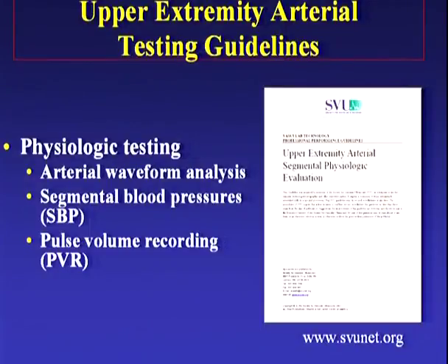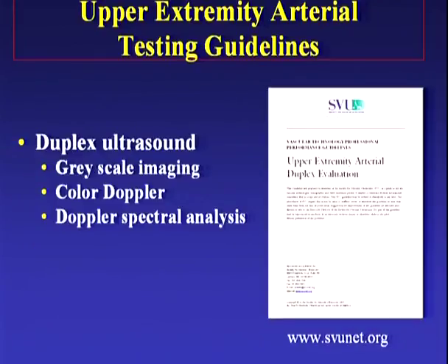As I mentioned, we're going to look at two guidelines throughout this DVD. The first one is a physiologic testing guideline, which is going to look at arterial waveform analysis, segmental blood pressures, and pulse volume recordings. The second is geared towards duplex ultrasound itself, and you're pretty comfortable with that, I'm sure: looking at grayscale imaging, color Doppler, and the spectral waveforms to denote whether we have disease or absence of disease.